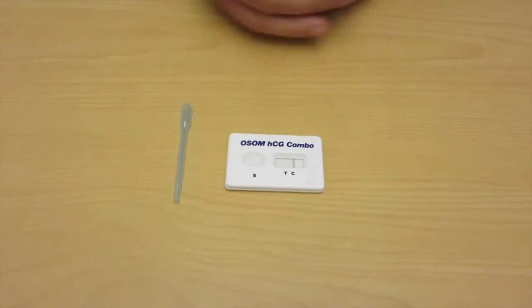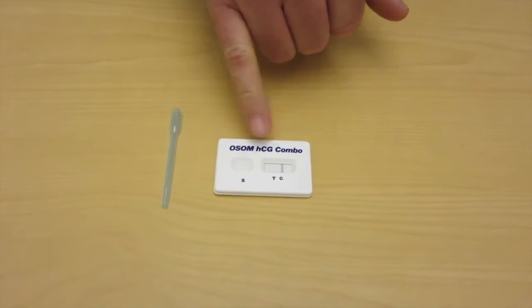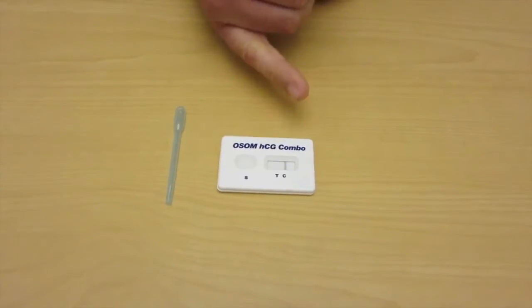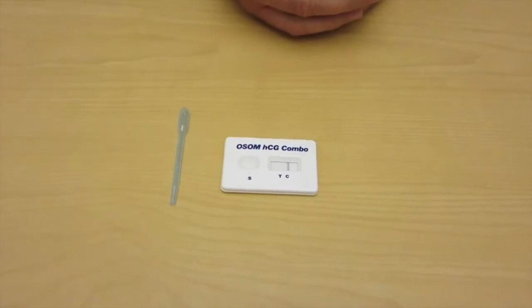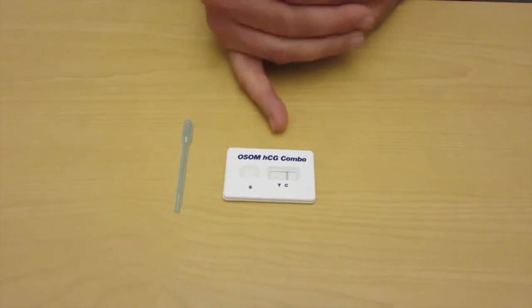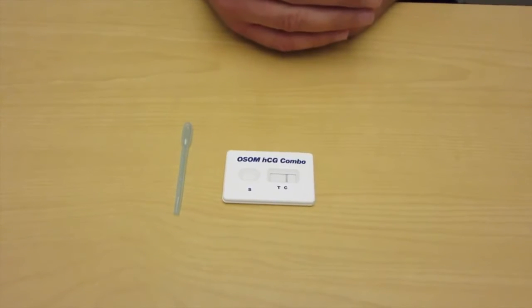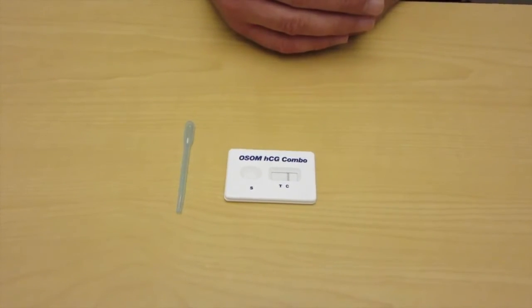Okay, so three minutes have transpired, or expired, and we have seen we have a control line nice and firm. There's absolutely no line on the test, so we're good to go. This is a negative pregnancy test, and we can proceed with our cares as indicated for a non-pregnant female patient.